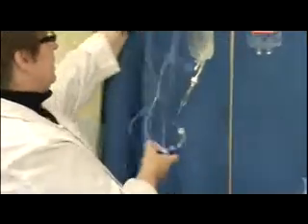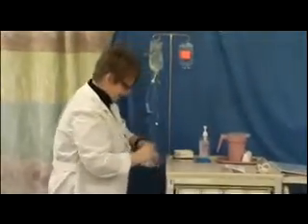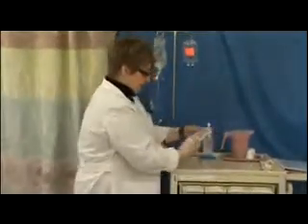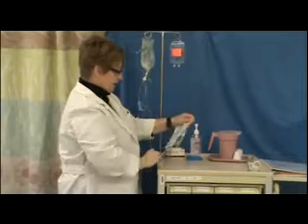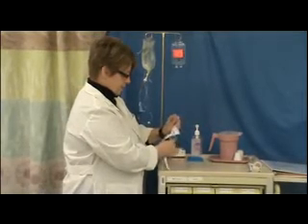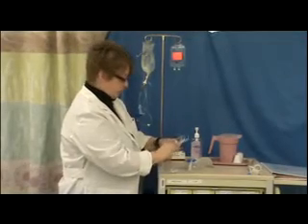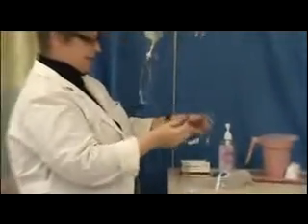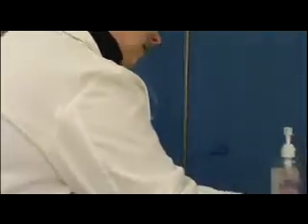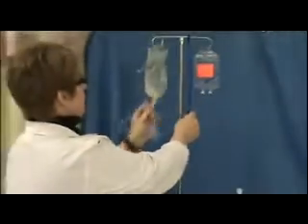Then we can set the primary aside, and we do the same thing with our secondary. The difference between the primary and the secondary, at least one of the differences is, the secondary is shorter. Secondary has some additional equipment here. The secondary has a, I'm not even sure what we call this. What do they call it? They call it a hanger. How about that? A hanger. So we'll put that there for now.